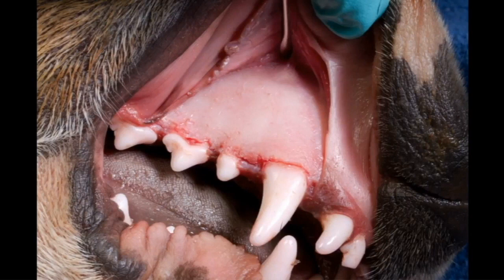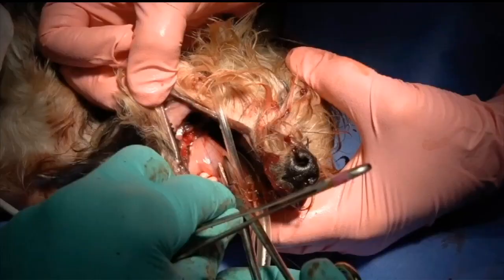Now, the majority of extractions you do, you're probably not going to have the luxury of an additional staff member trained in veterinary dentistry to help retract tissue. So it's good to learn to retract tissue by yourself, with the exception of small breed dogs and cats in the caudal oral cavity for closure or root tip removal. If you're in that space — especially closing a quadrant extraction on the mandible or a caudal tooth extraction site — it's great to have a technician to hold.